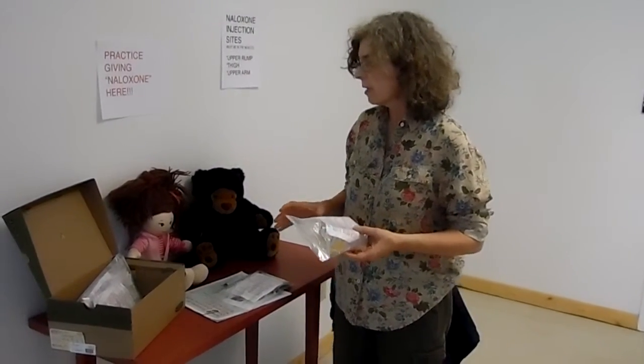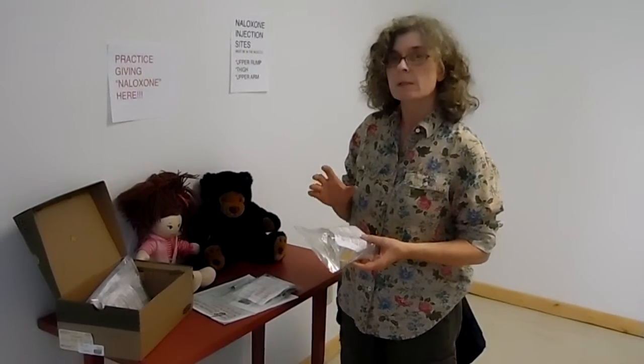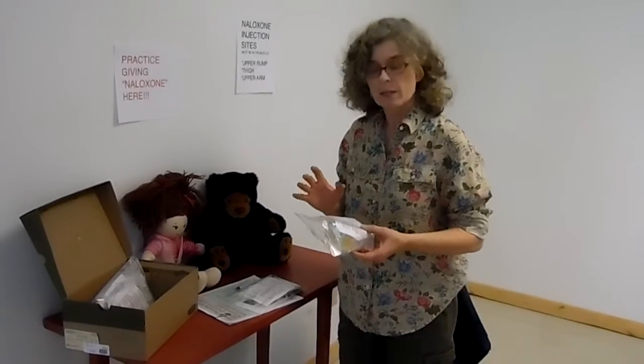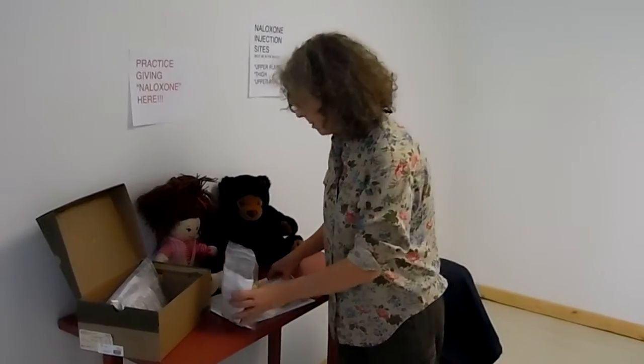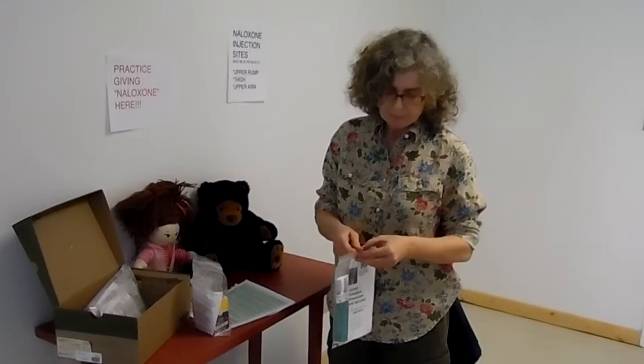What I have here are two variations of naloxone. There are three different forms of naloxone that I know of. This is the most basic form.